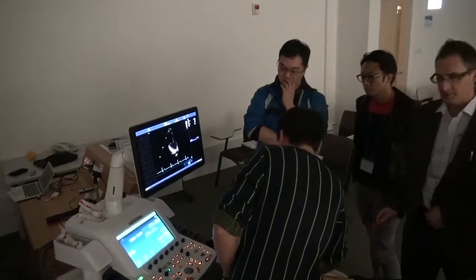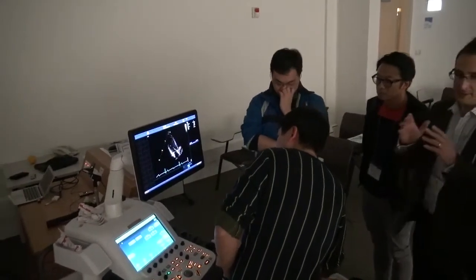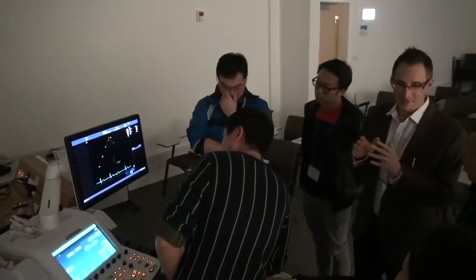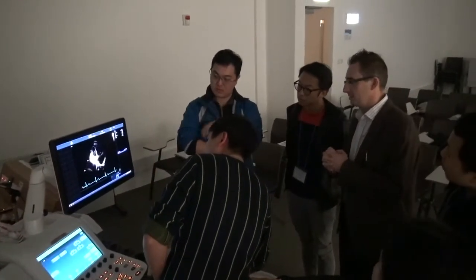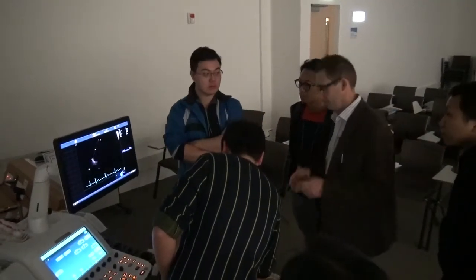So the functional measurements for ARVC: functional measurement really is any subjective assessment of wall motion. We can also do a fractional area change, a bit like an ejection fraction, but it's a bit more challenging. So I'm just going to show you TAPSE.